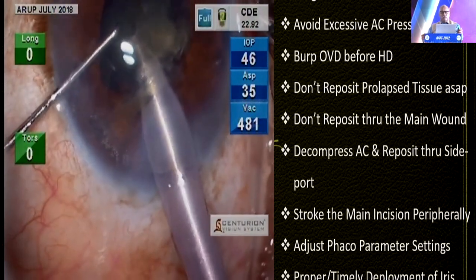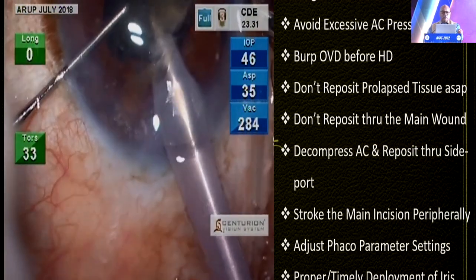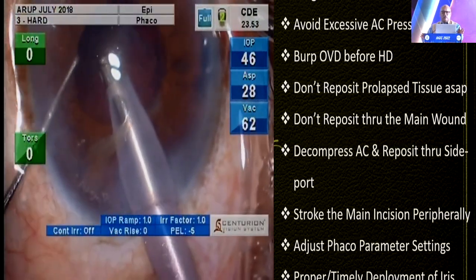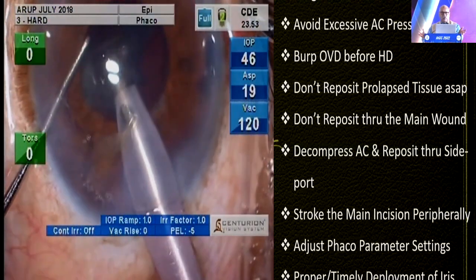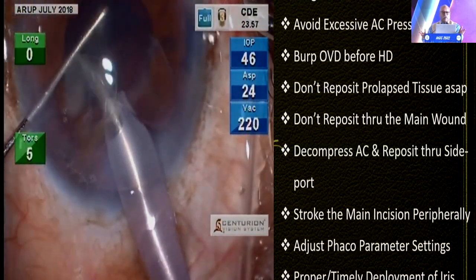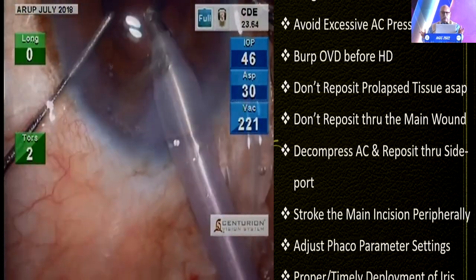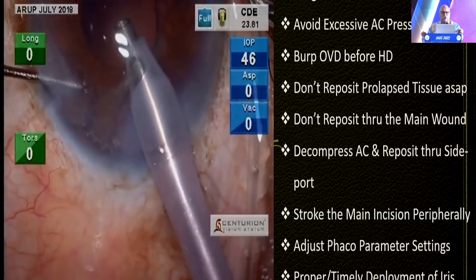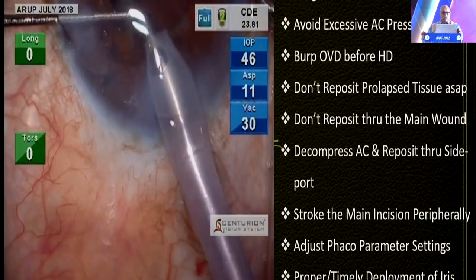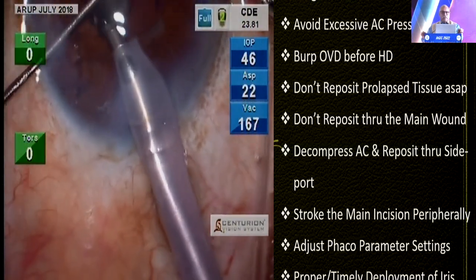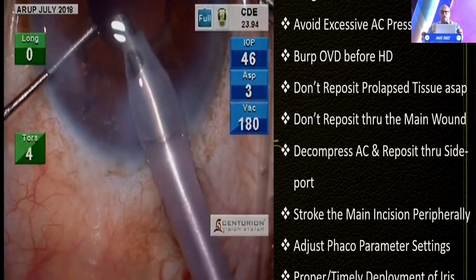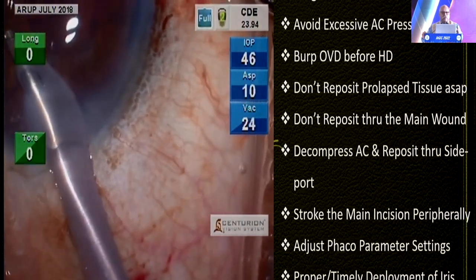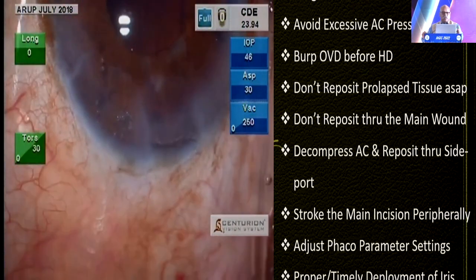It is usually easier to manage the nucleus through small pupil scenarios. When it comes to cortex management, though we had performed cortical cleaving hydrodissection, the patient still had a thick layer of cortical material in front of the capsule that had to be carefully manoeuvred. Make sure you don't leave behind even a small chunk of nucleus — ensure all tiny bits from the sub-incisional area under the main incision or paracentesis are brought to the phaco tip and emulsified. This is the last chip of nucleus taken out.